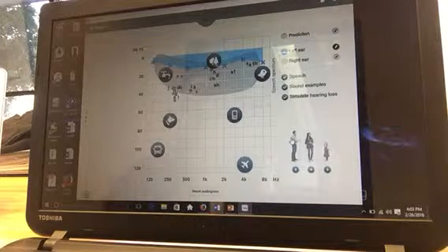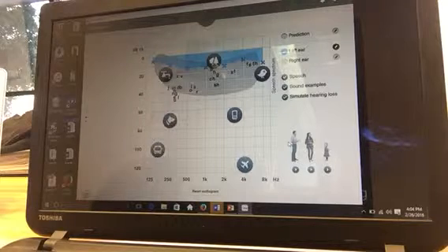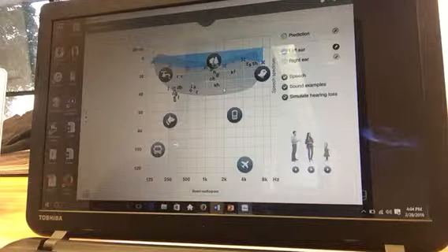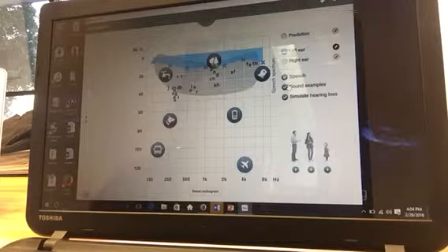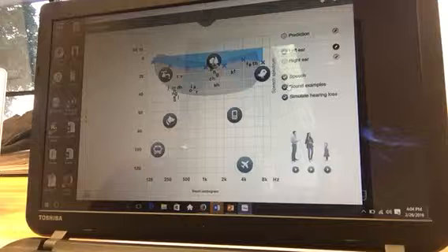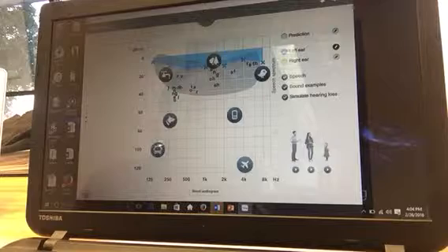Okay, so as you can see, he now has access to all of his speech sounds. For example, with the hearing aids in both ears, he's able to hear a lot of the sounds that he previously wasn't. He's also able to get a lot of those very important consonants that he was previously missing, which help when trying to identify words, trying to spell out words, and for listening purposes. However, he will still have some difficulty listening in noisy situations, even with both hearing aids.